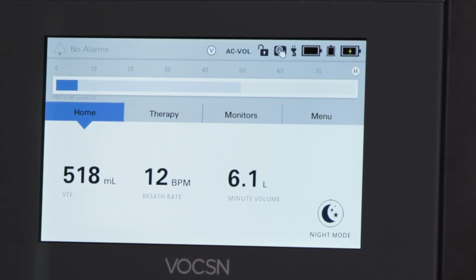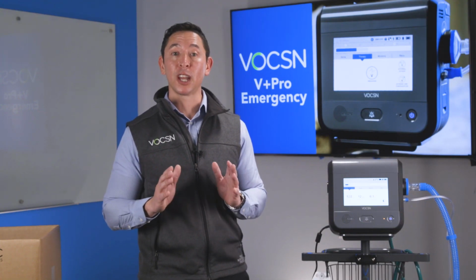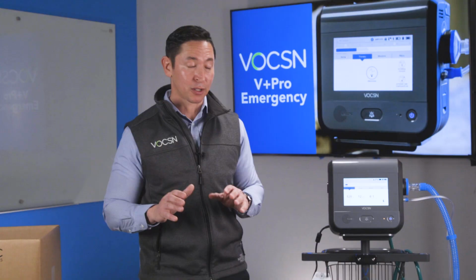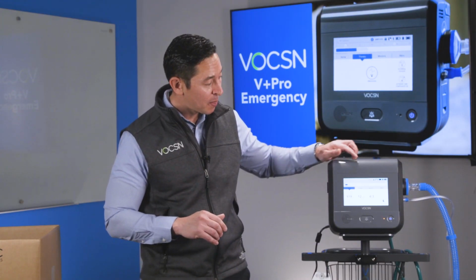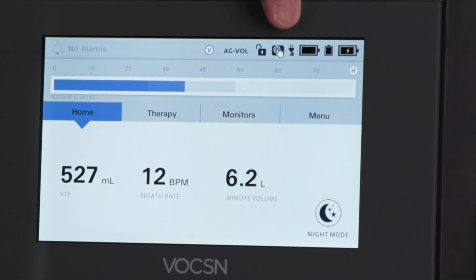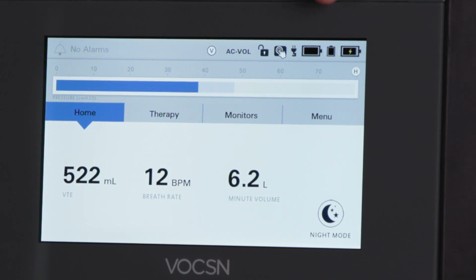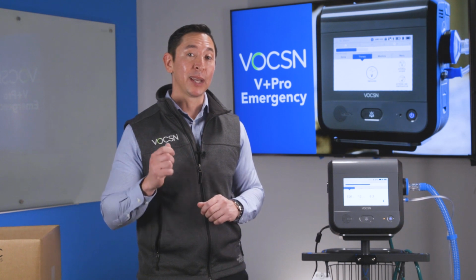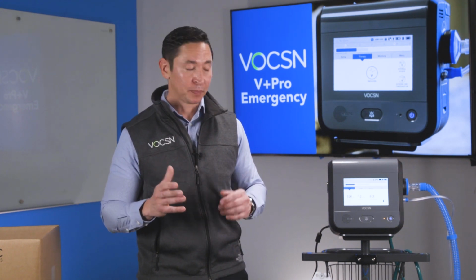Next, you see we have a padlock. That's our clinician lock. Currently, right now, it is unlocked, so I can make whatever changes I want to the device. Next, we have a little white hand touching a touchscreen. That is our touchscreen lock. So you can actually lock the touchscreen so no one makes any accidental changes to the device. Next, we have a power plug icon. That lets me know the device is plugged into the wall and charging up. And then we have three battery icons. So we have two removable, rechargeable batteries, and then we have an internal battery as well. You get up to 9 hours of battery life on ventilation alone.